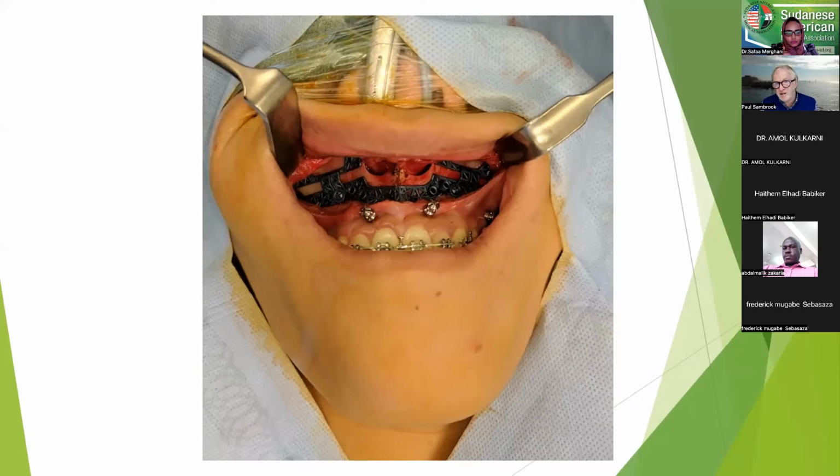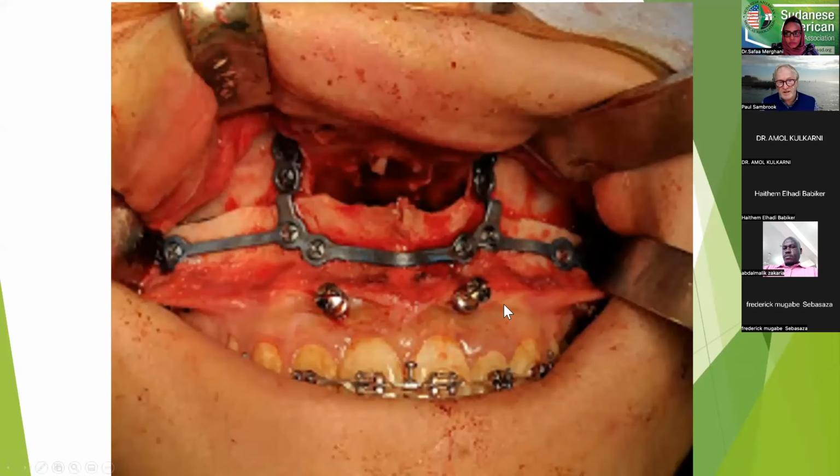You can see that the incision is probably a little bit larger than we're normally used to in orthognathic surgery, but the cutting guide gives you a very precise guide as to the amount of bone and the position of the bone that you're trying to remove. And following the osteotomy and the down fracture and the mobilization of the maxilla, this plate can then be placed on the maxilla to position it in the correct position without the need for condylar seating, without the need for intermaxillary fixation.